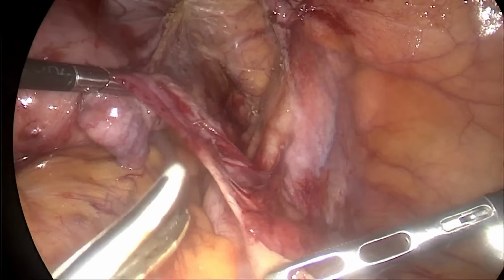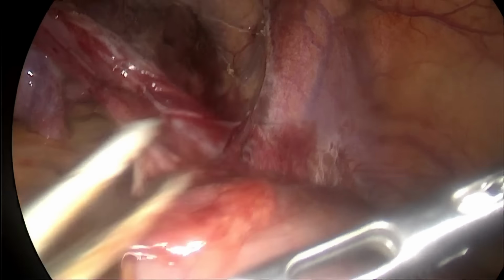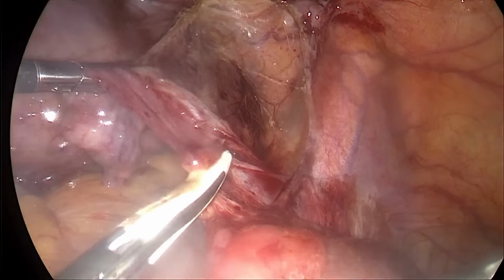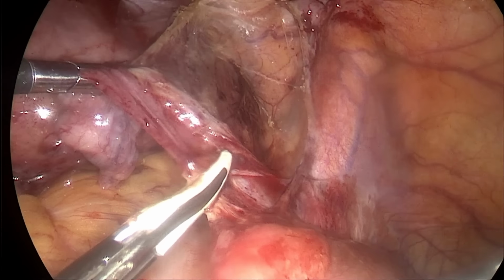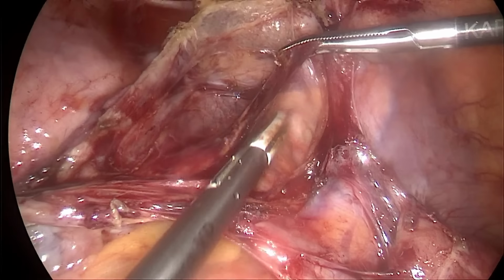Hello everyone, this is a case of high-grade serous endometrial cancer. Apparently the patient is in stage 3C2. In the imaging, multiple pelvic and para-aortic nodes were enlarged. So we are proceeding with the debulking surgery in this case.